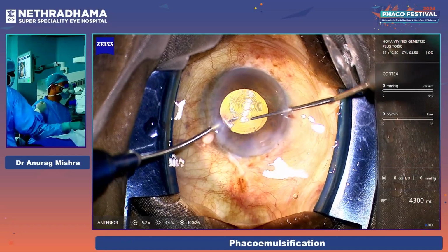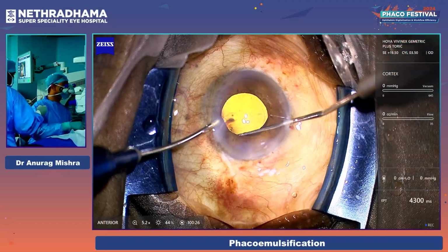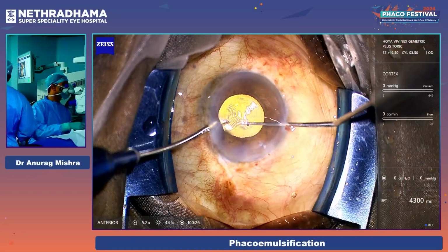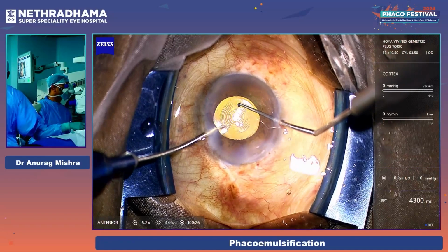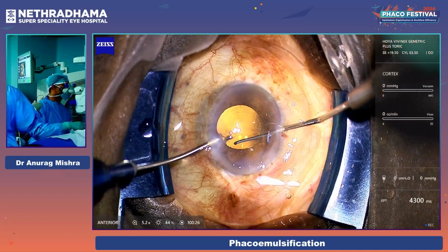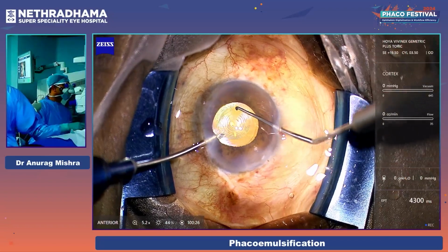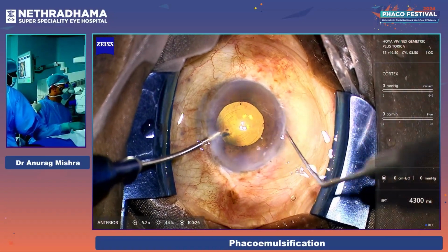Can I have the 3D glasses, please? Yep, thank you. We are close. And we are bang on. Yeah, that does it.